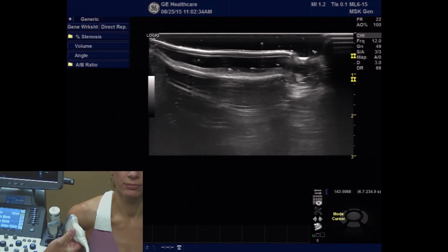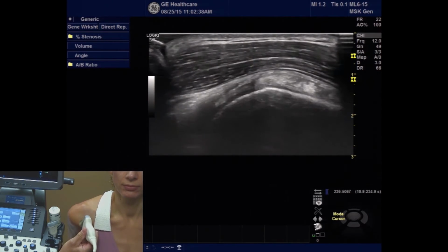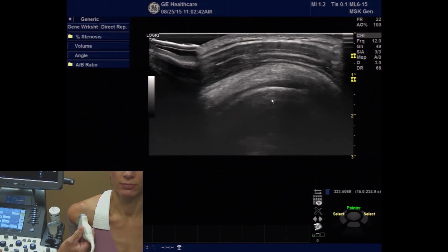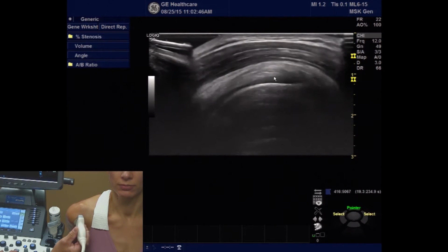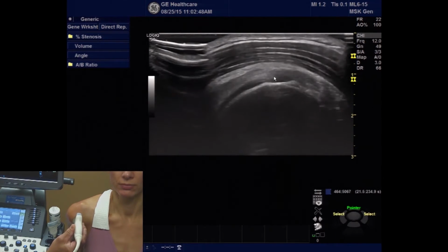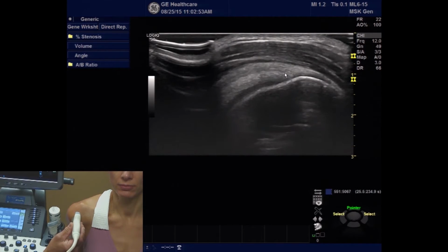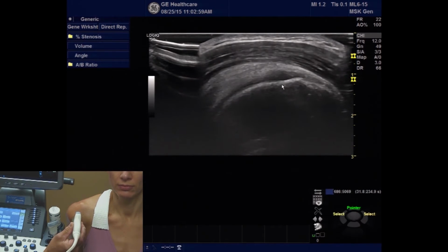And again, our most medial landmark is going to be looking for the biceps tendon medially, which is the structure right here. Now I'm going to be moving the transducer out lateral, and we're going to be able to see the supraspinatus tendon in its long axis as it inserts onto the greater tuberosity.